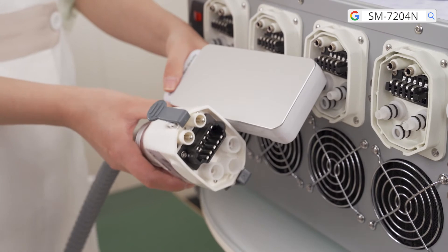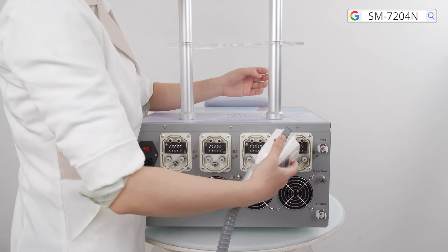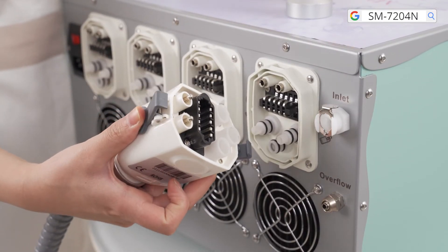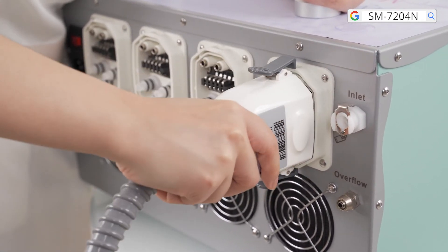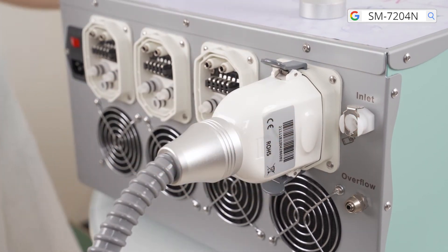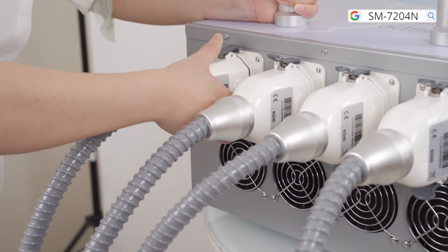To connect the cooling applicator to the machine, press and hold the fastener and insert the connector by aligning it with the small holes at the connection until it clicks into place. Connect the remaining cooling applicators to the machine in the same way.